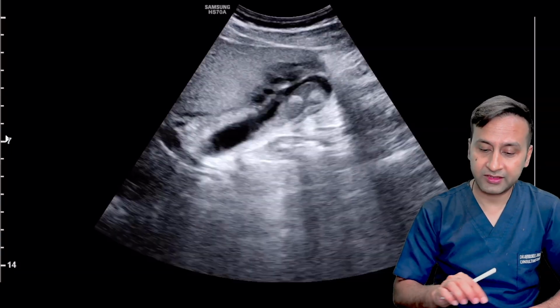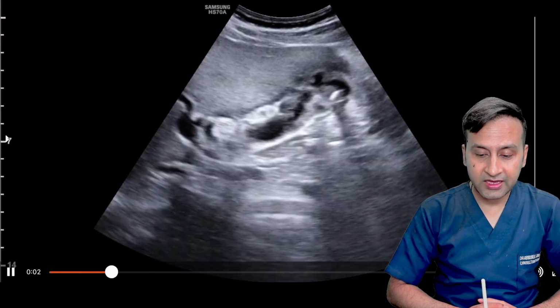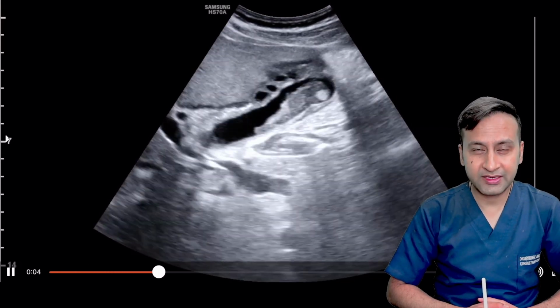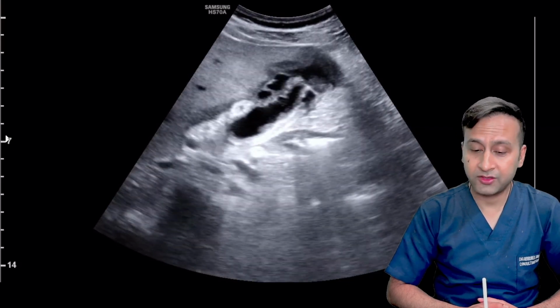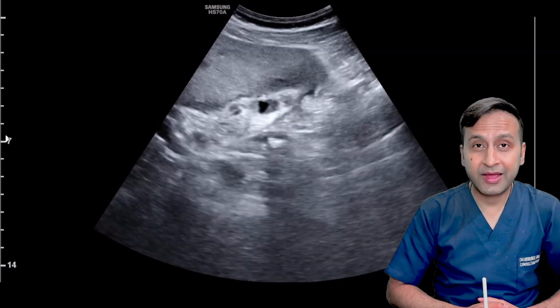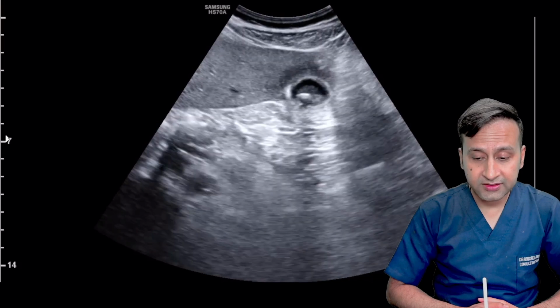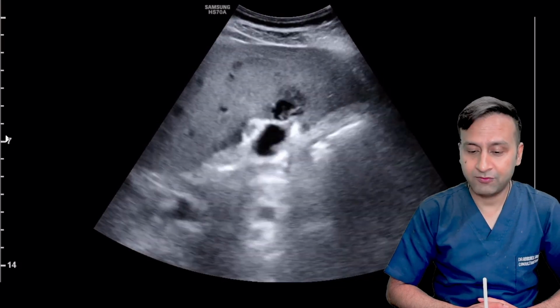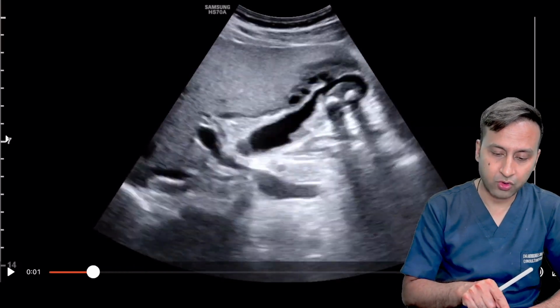So let's have a look at the sonographic image first. So this is the cine loop, and I hope all of you are going to agree with me when I say that the primary pathology is the gallbladder. The gallbladder looks abnormal. I think all of you can appreciate the calculi, the sludge inside the lumen, but I also want you to have a look at the gallbladder wall, the adjoining areas, the subhepatic fat, and the liver bed. So let's play this video once again. I hope you've already made your own observations.